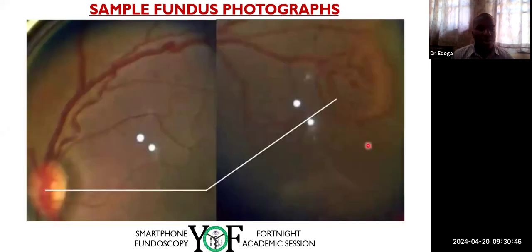So for pediatrics, I've been able to use the smartphone to do screening of newborns, preterms that we are screening for retinopathy of prematurity. So you could see a montage of 2 smartphone images that I brought together.